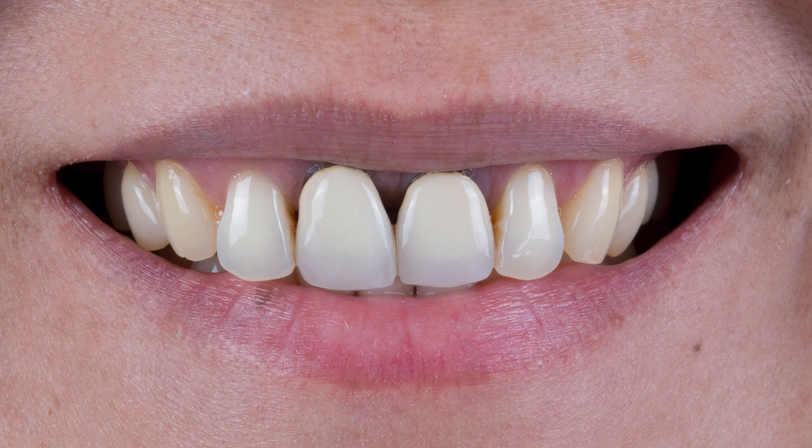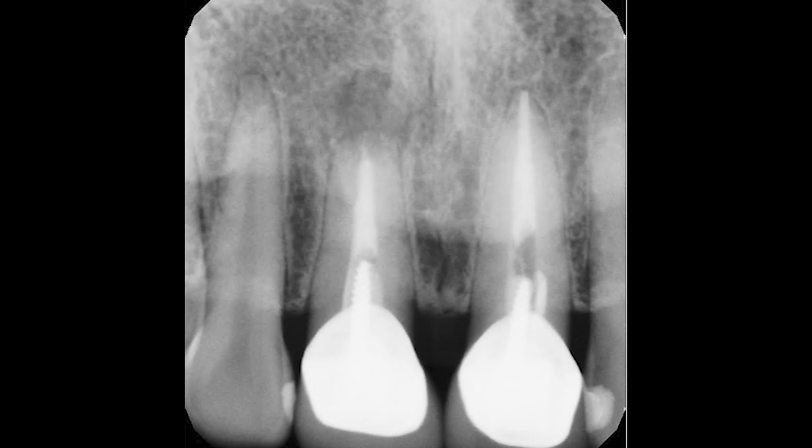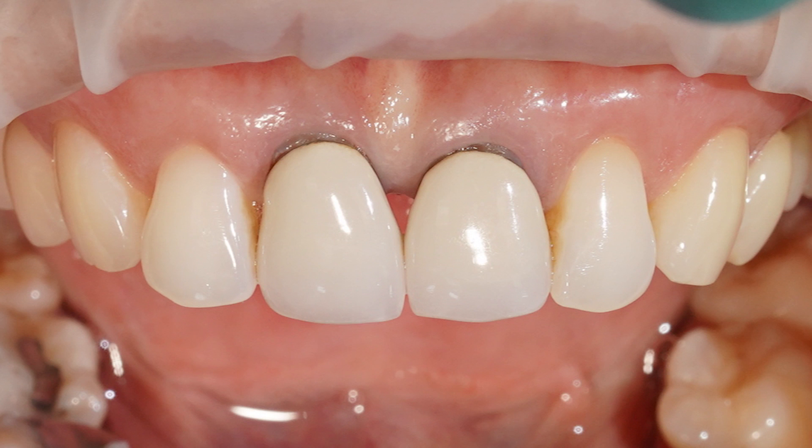There's also another reason why we want to replace these. As you can see in the radiograph, there is a periapical radiolucency on number 8. We will refer this patient to an endodontist for retreatment. Before that happens, we are going to make things easier for the endodontist by removing the old restorations and provisionalizing the teeth.